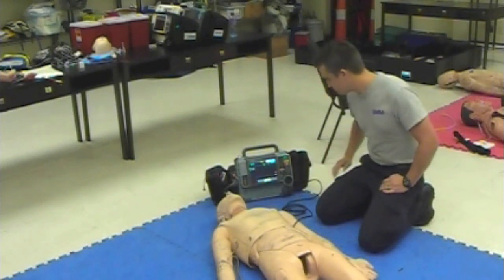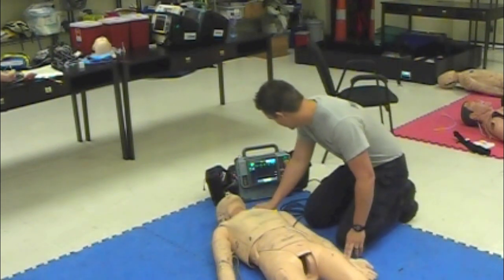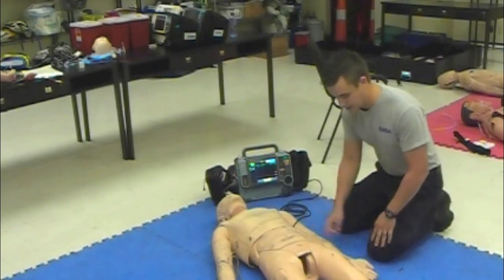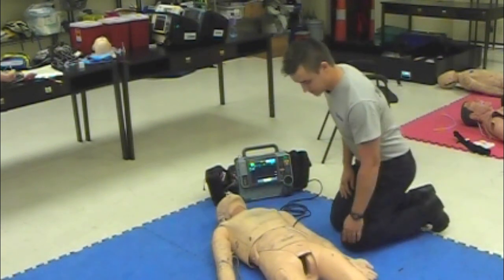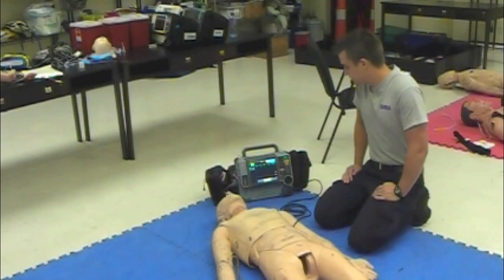All right, it's been 2 minutes. Okay. I'm going to do a pulse check. Do you have a pulse with this? No pulse, it's PEA. So continue compressions, continue ventilations. I'm going to get IO access at this time. Okay. And I'm going to intubate also, and also push 1 milligram of 1 to 10,000 of epi. Okay, that's in.